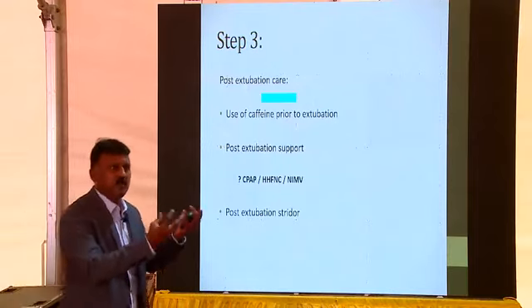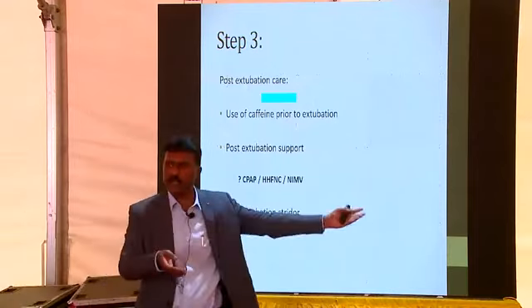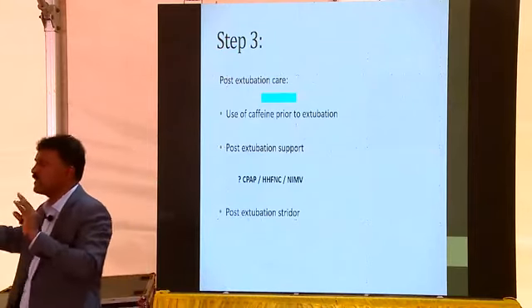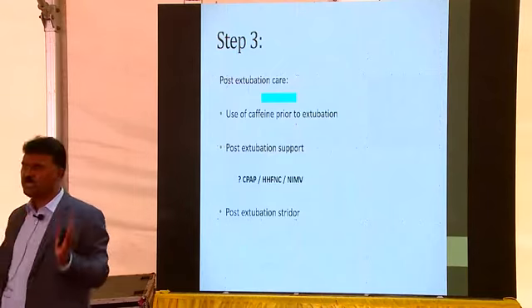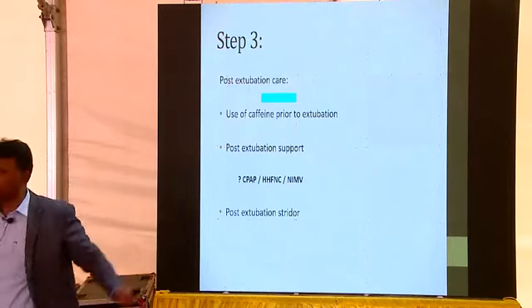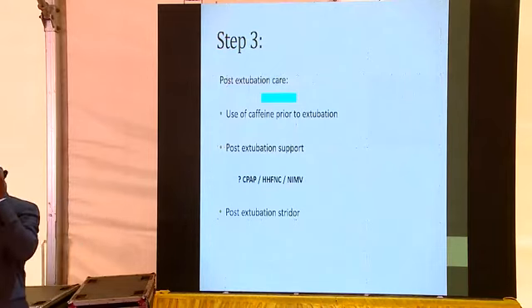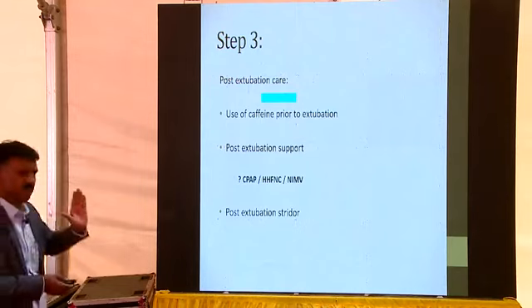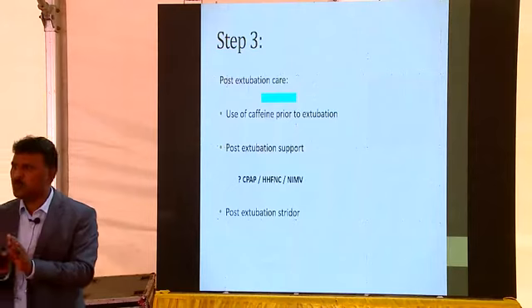Put on some kind of non-invasive support till you feel the baby is breathing very well, and then gradually wean him off. That is a better way to do it. It is not that I was doing everything and suddenly I take it out and say, now it's your life, enjoy. No, he is still going to need some kind of support, and the best support is non-invasive. What options do I have?